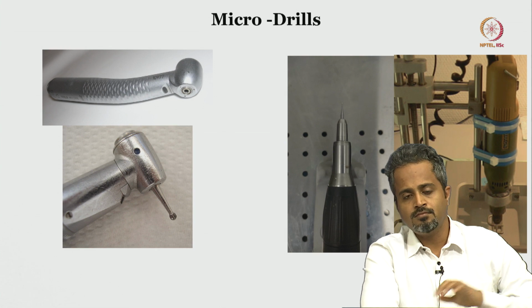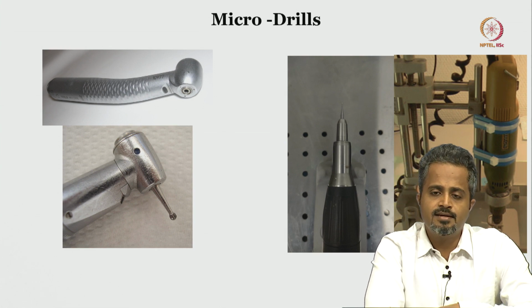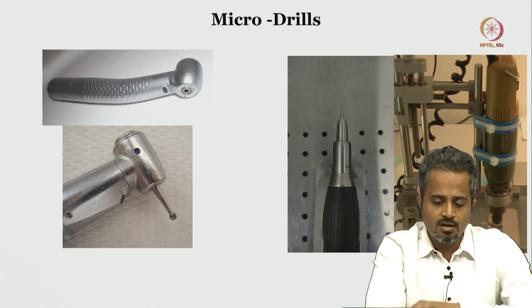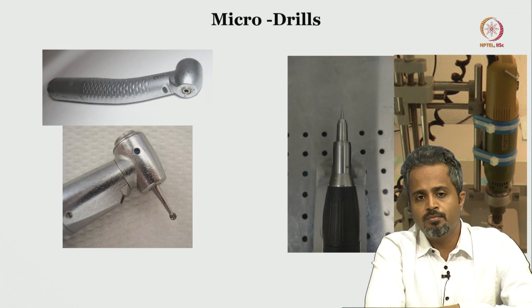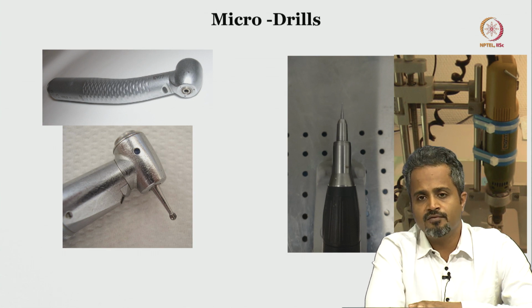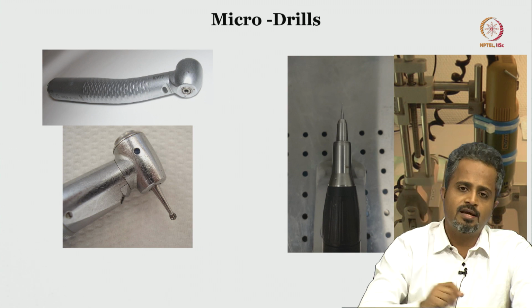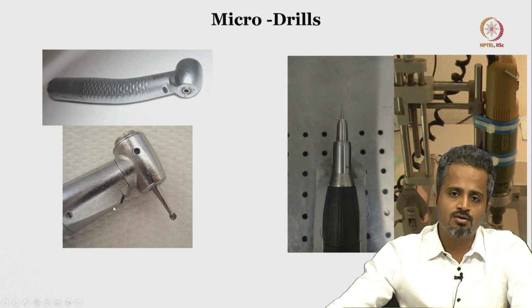So, coming to the actual surgical steps. This has been discussed in detail in the previous session, so I will not dwell too much on it, but just to give you a brief recap, on the left hand side you have a dental micro drill, on the right hand side you have the coaxial system of the drill, which is a bit heavier than the left.